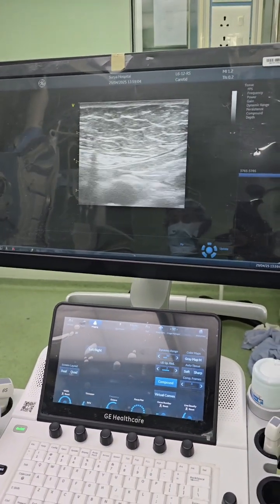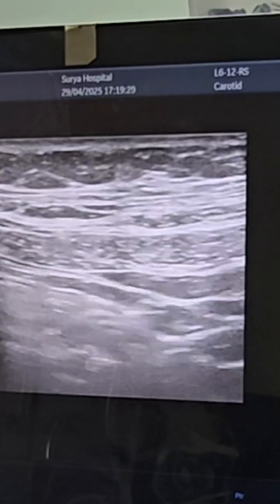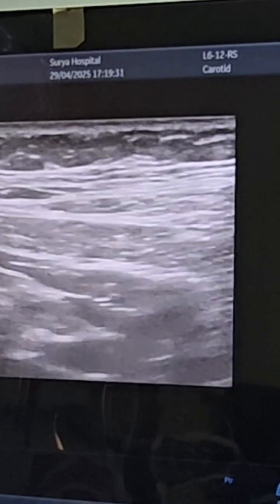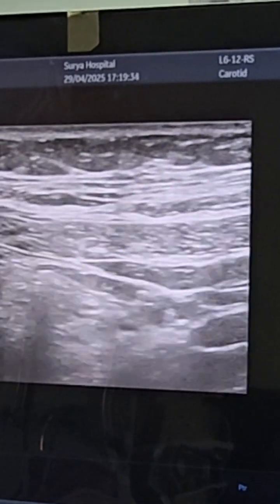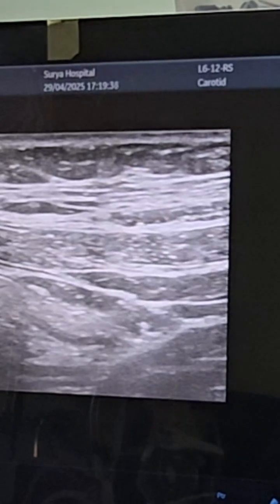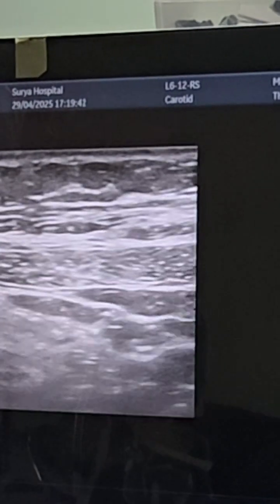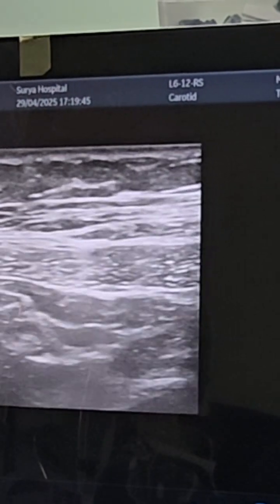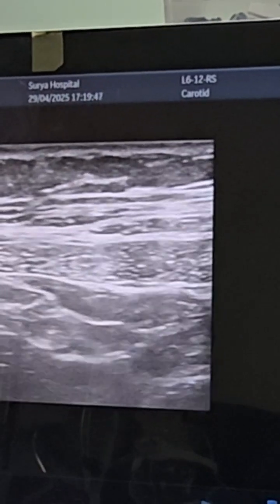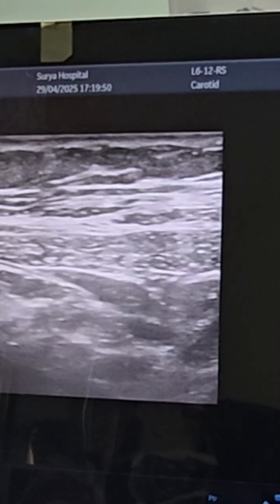Hello everyone, let's talk about TAP block. TAP block is Transverse Abdominus Plane block, which is a fascial plane between internal oblique and transverse abdominus muscle — the innermost muscle layer of the anterolateral abdominal wall. As you can see in the video, the three layers of the abdomen — external oblique, internal oblique, and transverse abdominus muscle — with the TAP plane can be appreciated.